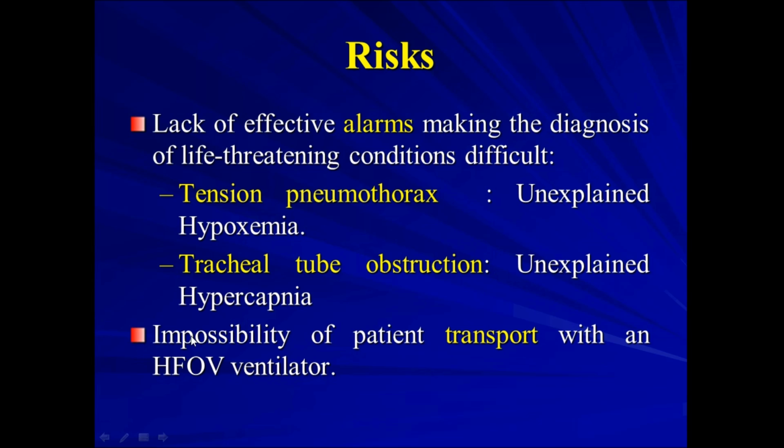Another problem with the high frequency machine is that you cannot transport the patient. Let's say you want to do some procedure, like a CT scan, you cannot transfer the patient with the high frequency ventilator.